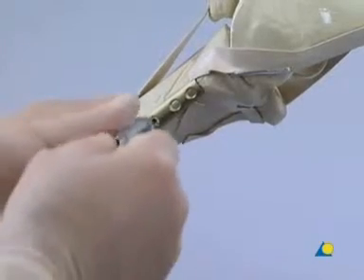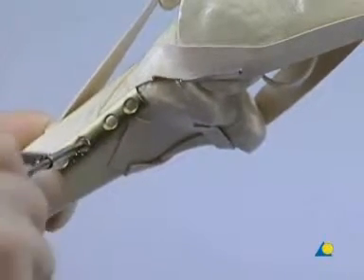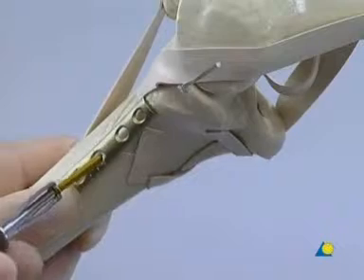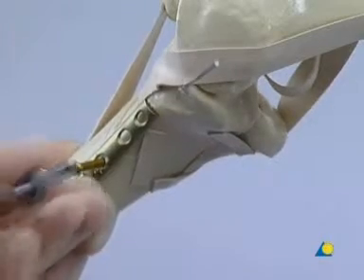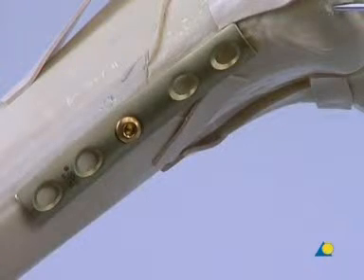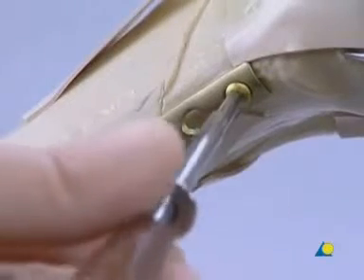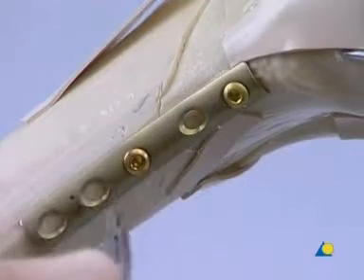A depth gauge is used to measure. A 3.5 mm tap and corresponding sleeve are used to cut the threads. A cortex screw is inserted through the middle hole of the plate. This maneuver pulls the plate into its anti-glide or buttress position, thereby reducing the fracture indirectly. Next, a cortex screw is introduced through the most proximal plate hole. After placing the most proximal screw, the first screw will need to be re-tightened.